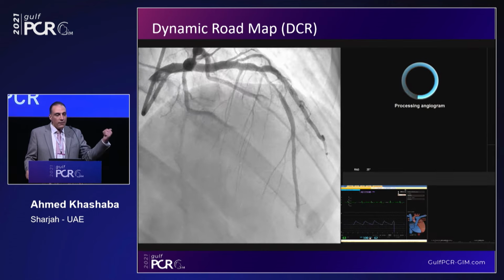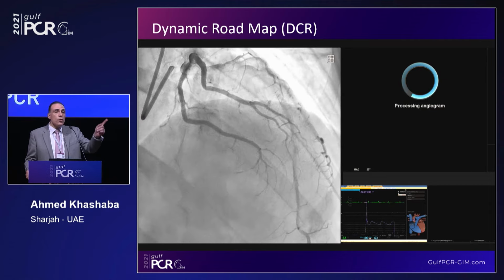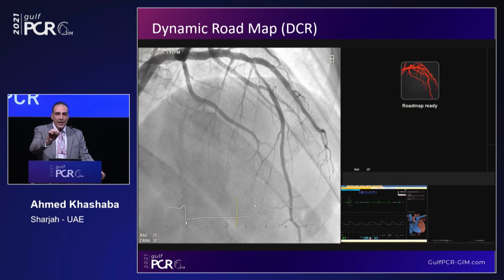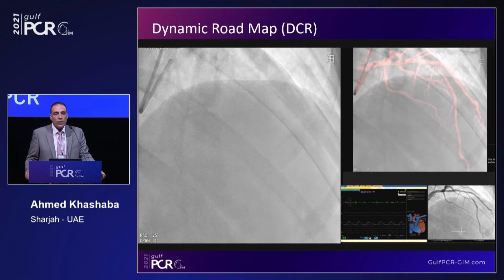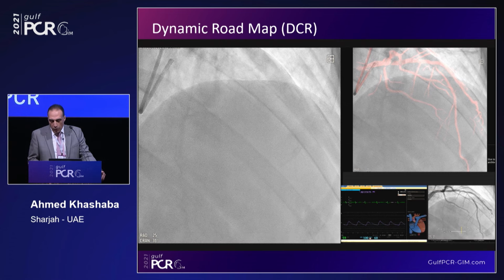And from the previous rotational cardiac swing, you select, it gives you all the angles while it is rotating. So you select the best angle, detect the angles itself, and then go directly to this view. Have one more shot. This view has been taken with only 4 cc's. 2/4 in the settings of the injector, and then after you press the angio again, you get this roadmap. So you have your coronary tree overlaid without any more contrast given.